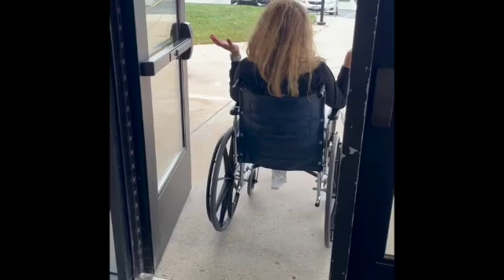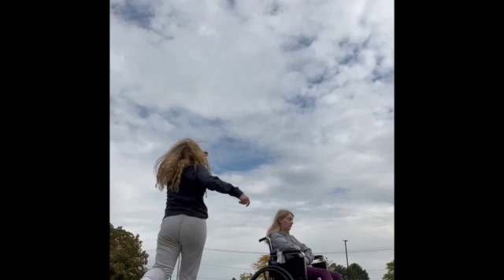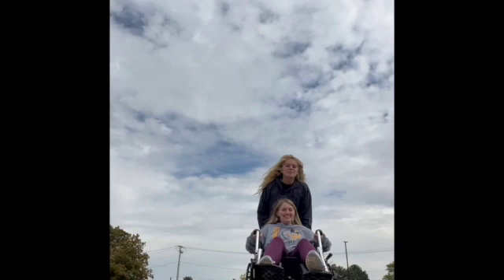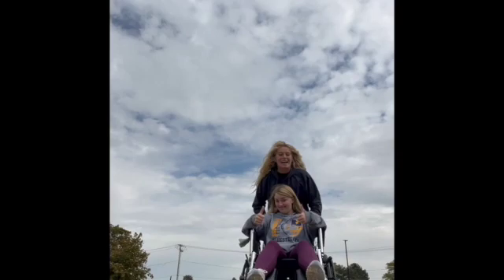To go up a curb with a patient, tip the wheelchair backwards so the caster wheels up front are above the curb, and then pull the wheelchair up.